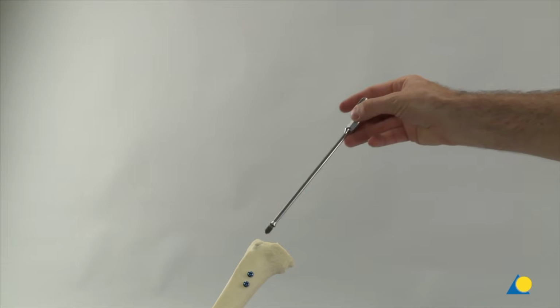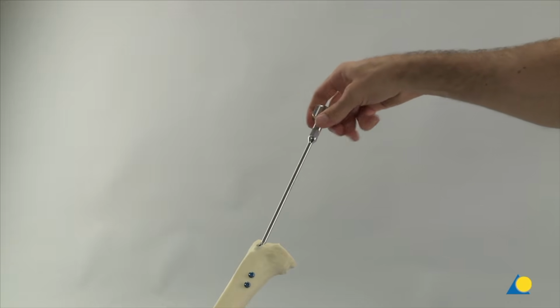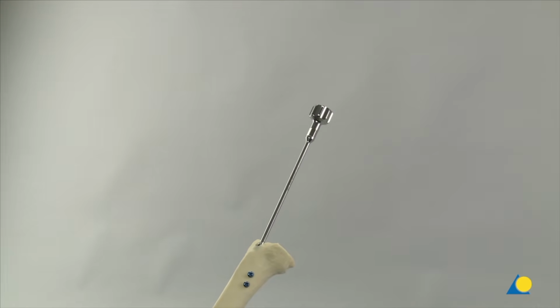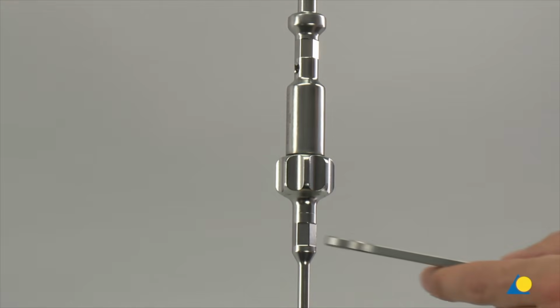To prevent rotation of the nail or displacement posteriorly, the extraction screw is threaded into the nail and tightened with the combination wrench prior to the removal of the locking screws. The hammer guide is attached to the extraction screw and tightened with the pin wrench.